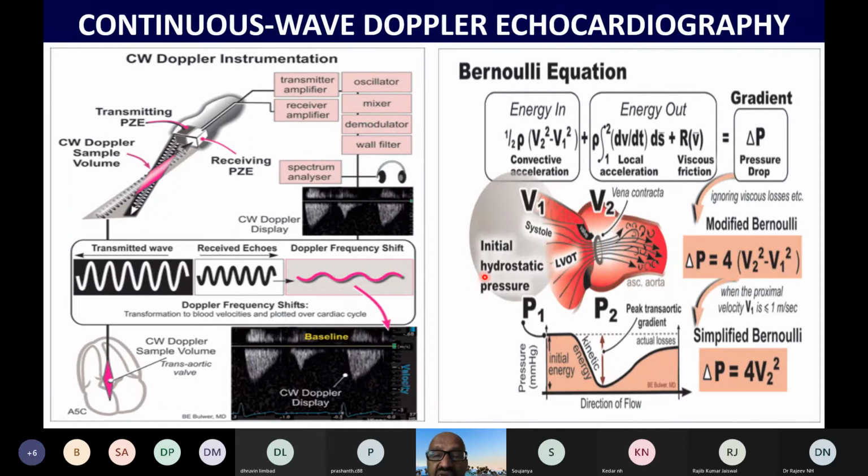So the ultrasound beam, the continuous wave Doppler beam, when we put it across the aortic valve in stenotic lesions, gives us the maximum pressure gradient. Because of the loss of pressure in the process of conversion of potential energy into kinetic energy, we are measuring the pressure gradient here. So because of the loss of pressure here, the pressure gradient will also be read higher than what it actually is, because of the pressure recovery phenomenon.